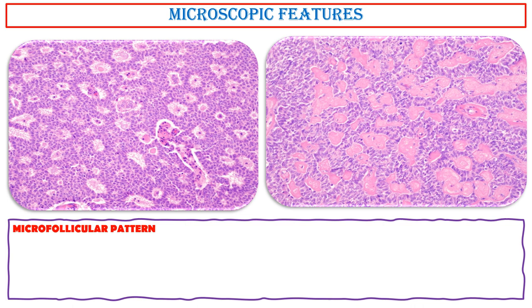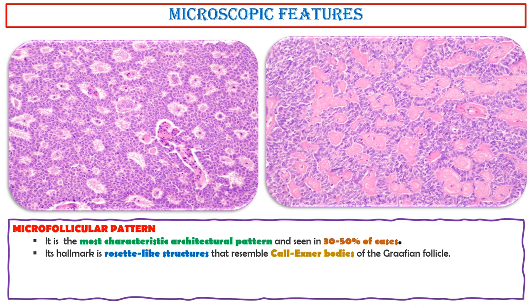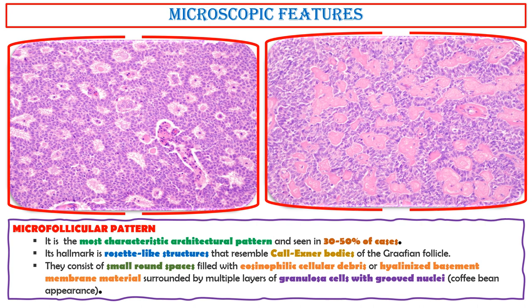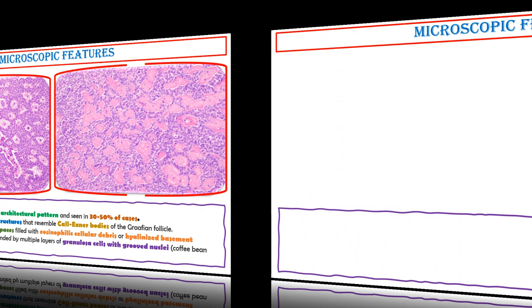Microfollicular pattern. It is the most characteristic architectural pattern, seen in 30 to 50% of cases. Its hallmark is rosette-like structures that resemble Call-Exner bodies of the Graafian follicle. They consist of small round spaces filled with eosinophilic cellular debris or hyalinized basement membrane material, surrounded by multiple layers of granulosa cells with grooved nuclei — that is, the coffee bean appearance.